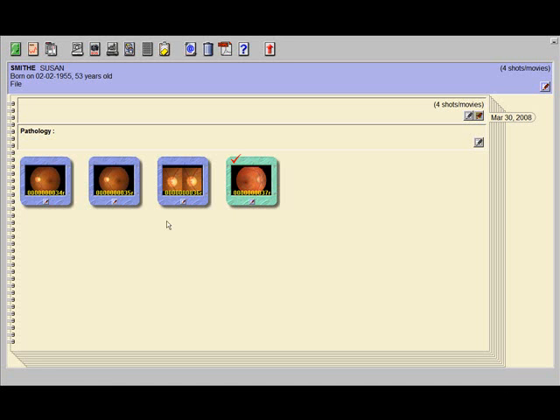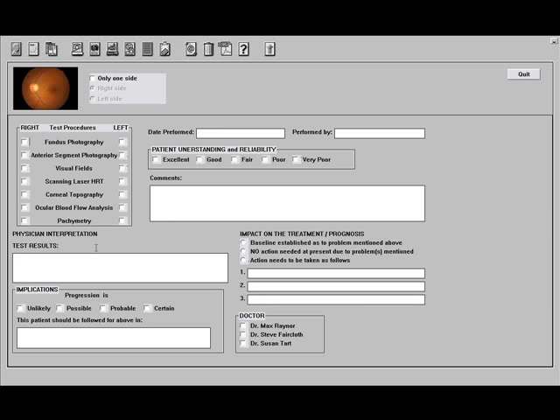If you wish to create a report pertaining to a particular picture, click on the notepad at six o'clock. You'll note that you can indicate if this is a left eye or a right eye by clicking one side only and marking it right or left. You can very easily complete this form by checking boxes and typing comments.